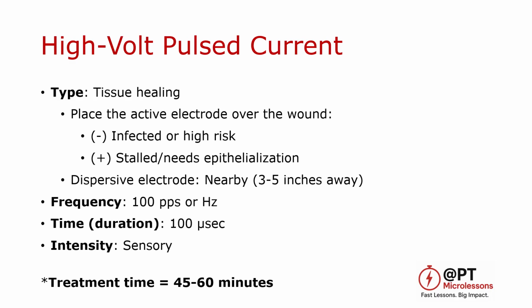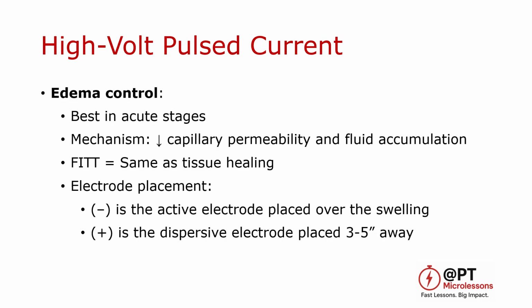Frequency is set around 100 pulses per second. Pulse duration is approximately 100 microseconds. Intensity is set at a sensory level. Lastly, the treatment time is commonly 45 to 60 minutes. Next, we will look at edema control.